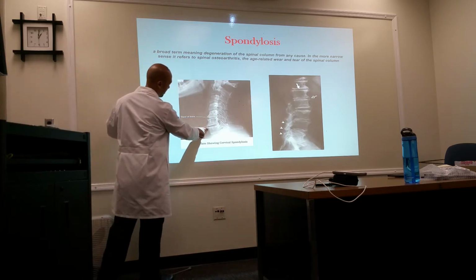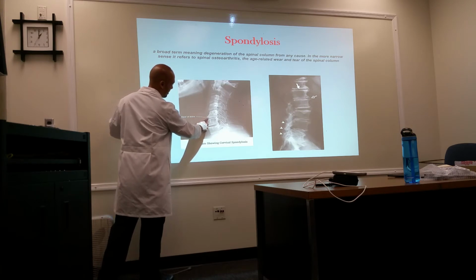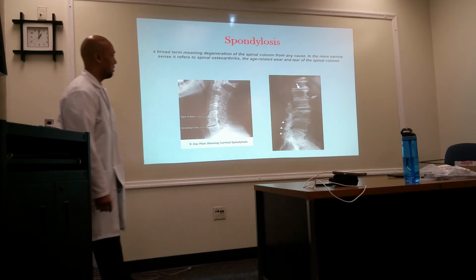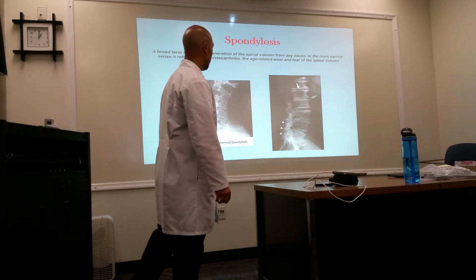You will see things like this, where it looks like there are some changes at the body, and there are parts of the body that are fractured. And that's, again, normal, usually due to age.